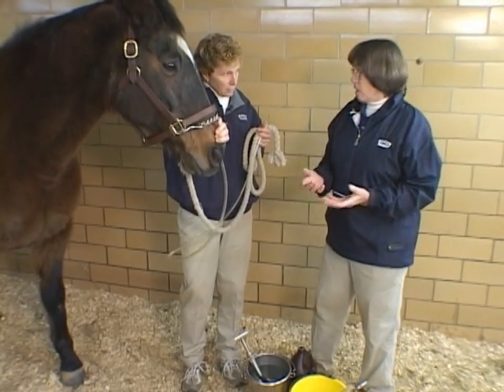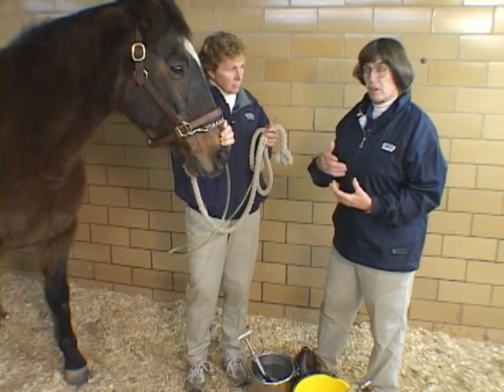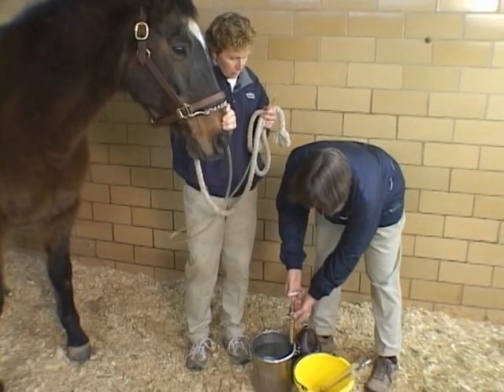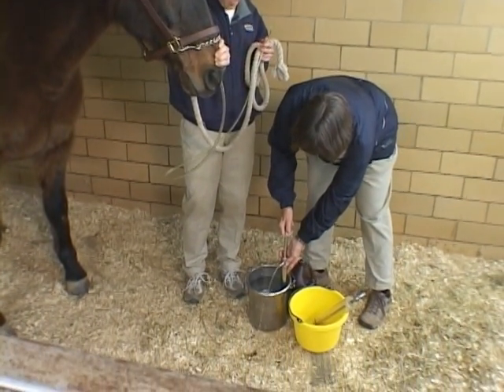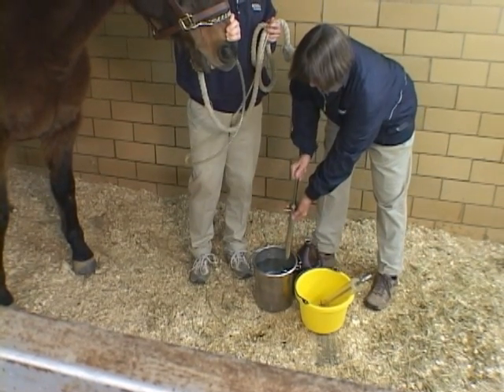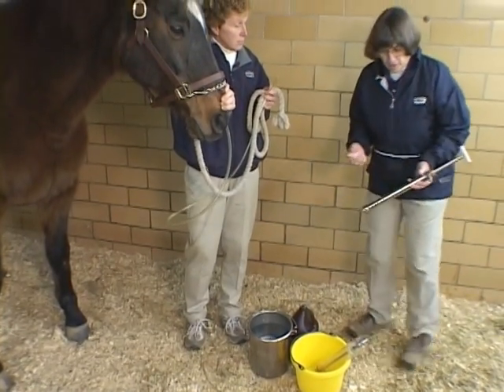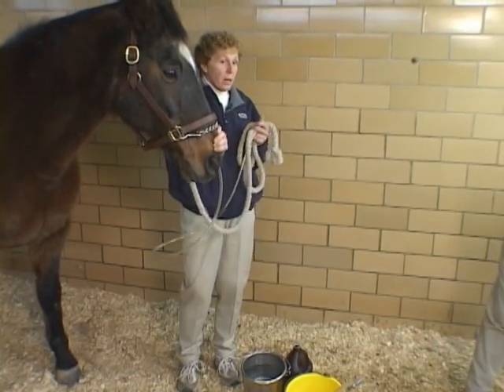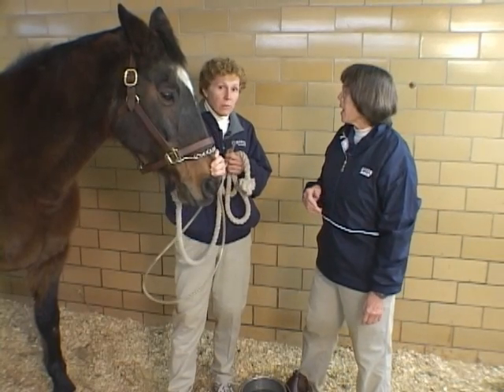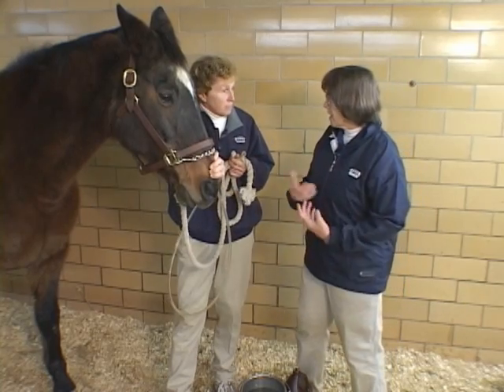If I was going to be giving a large amount — like fluid therapy, two gallons of fluid into a stomach — I would perhaps be using something like this stomach pump that can really get quite a flow going. That would only be used in special circumstances when you'd want high volume. Like when I used to oil a lot of horses that were shipping and gave them a half gallon of mineral oil, I commonly used the stainless steel pump — so that you can get it in in a hurry.